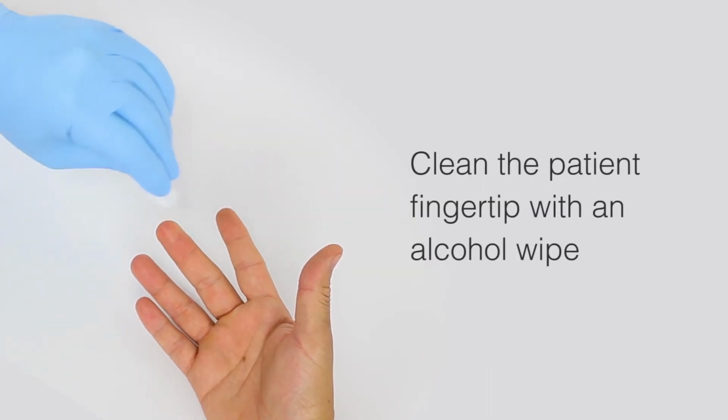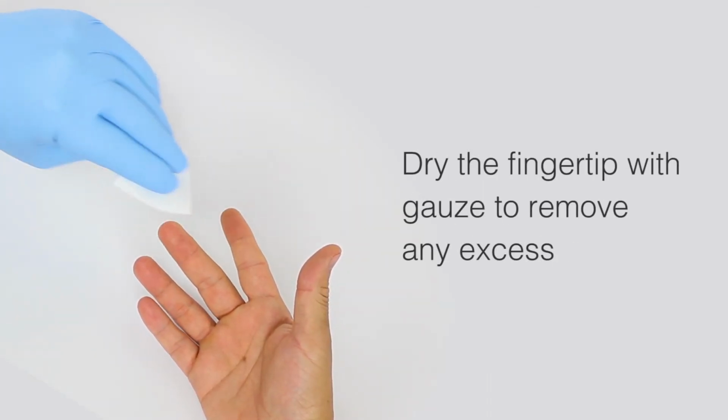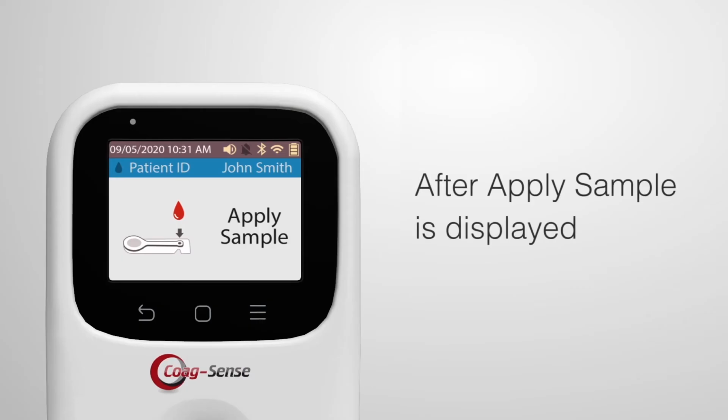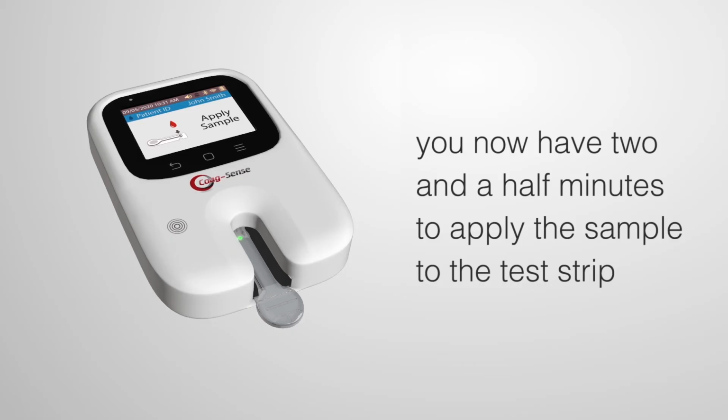Clean the patient fingertip with an alcohol wipe. Dry the fingertip with gauze to remove any excess. After Apply Sample is displayed, you now have 2.5 minutes to apply the sample to the test strip.